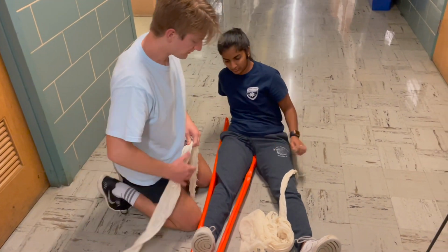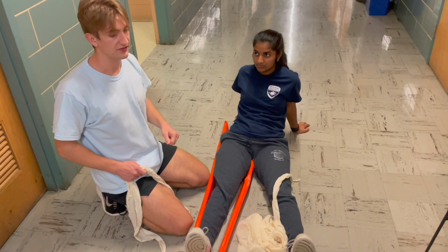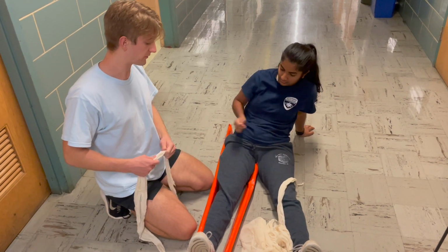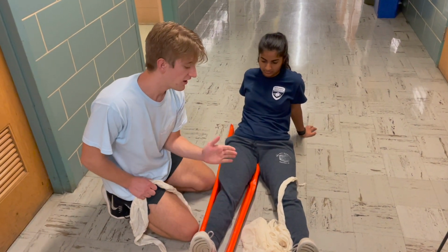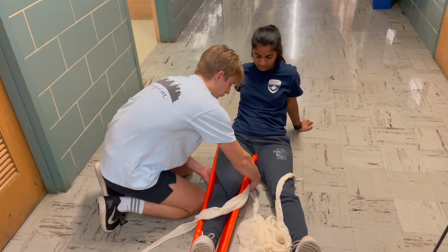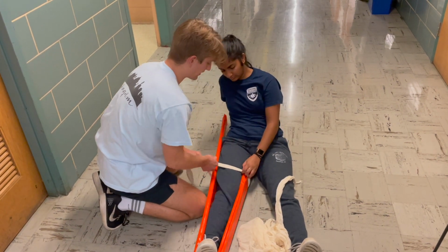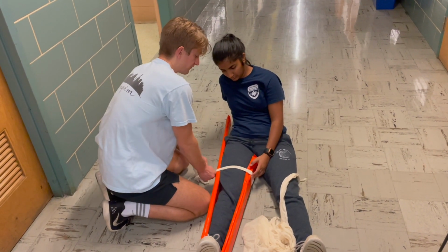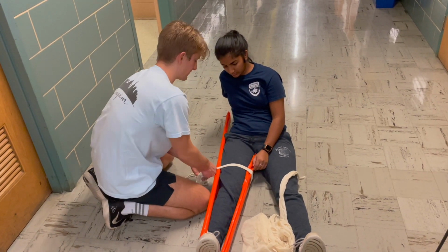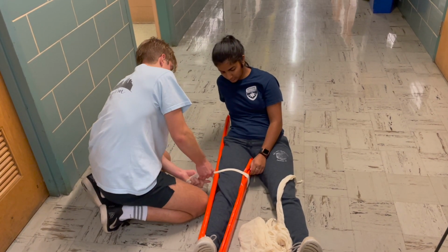So remember that when we secure boards to patients, we're going to do so in a way that does not exacerbate injury or be uncomfortable for the patient. So if my injury is right here, I'm not going to tie right over the injury. We can start by doing one tie at the top on the patient's femur. Depending on their anatomy, you may opt to do 2 ties up here at the femur, depending on where the injury is. This can all be different, but with 3 ties total, I'm going to do 1 on Ashani's femur.